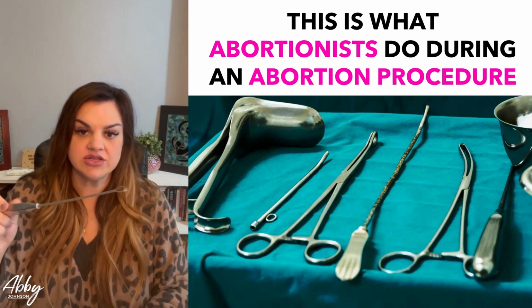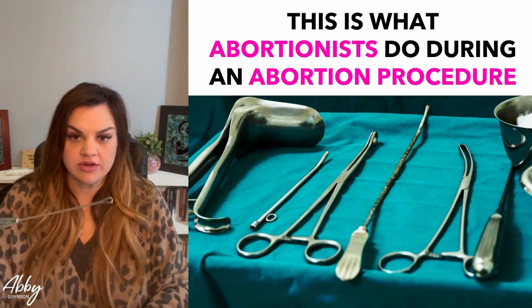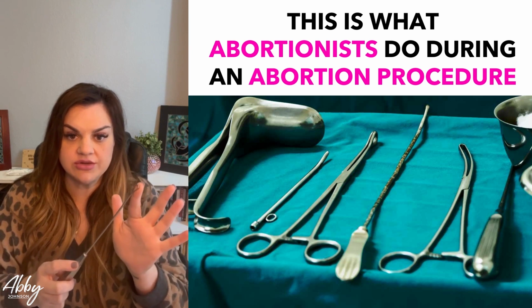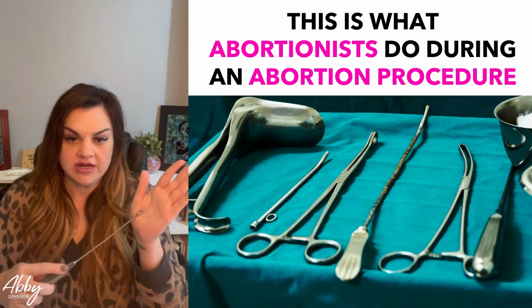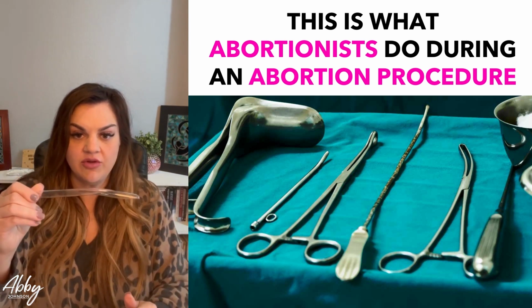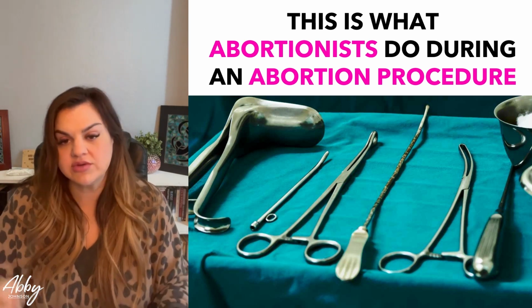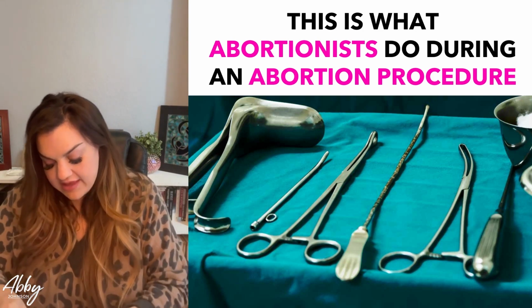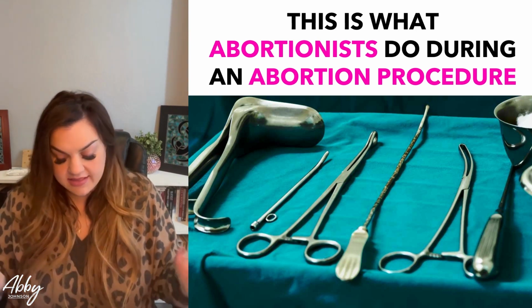They take this and they insert it into the woman's uterus, and they will take this and scrape the inside of her uterus. And they want to make sure that they have removed all of any additional tissue. They take that and they scrape it like this inside of her uterus. And then they'll take this suction tube, they'll insert that back in, and they'll do a full pass around her uterus like this to make sure that they get any remaining blood and tissue out that was removed from the curette. After that, they will then remove this tenaculum out of her cervix, and that's it.